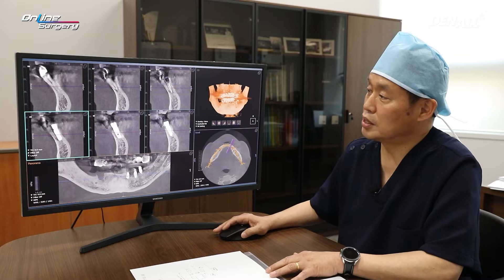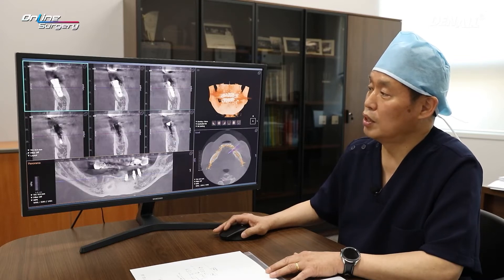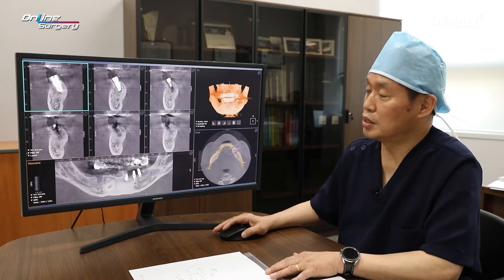In number four, implant placement was done. Number six and number seven implants were placed, and you can see that on CT.